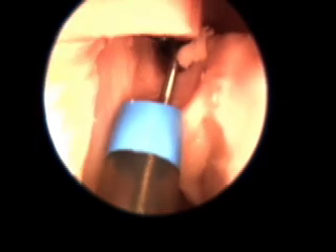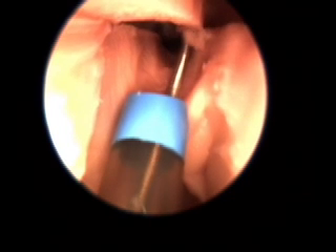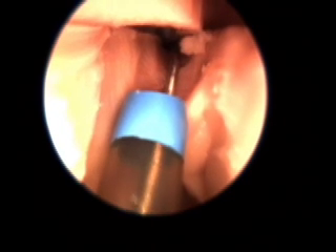When the opening of the right frontal sinus is identified, the guide wire is then threaded completely into the sinus cavity.